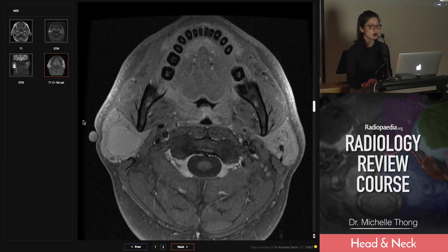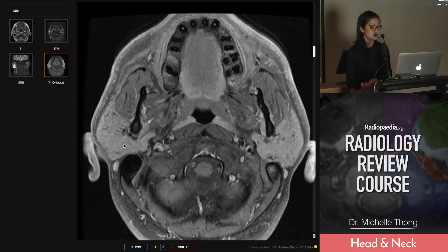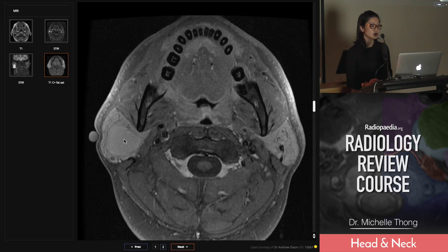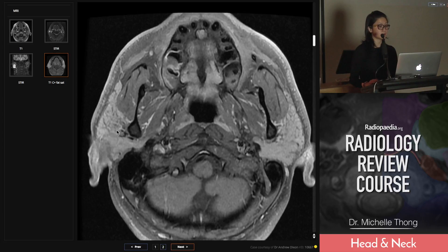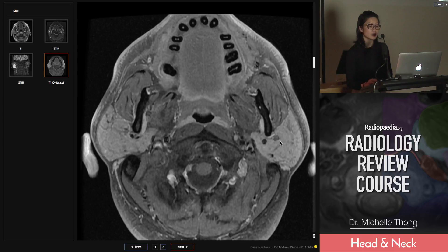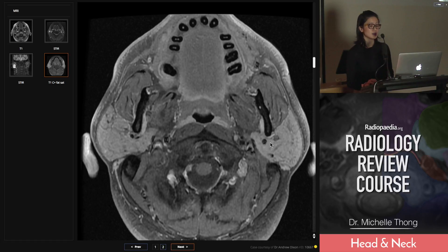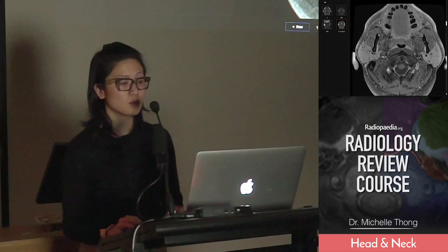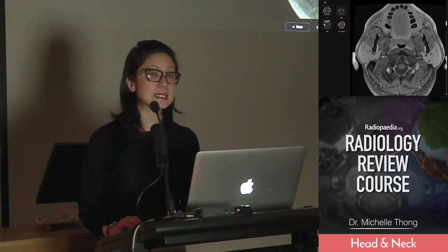We've got to think of other things. On the post-contrast study, this was internally proteinaceous content we saw on the T1, so it's not necessarily enhancing. And again, some of these don't enhance — some are complex little cysts. This ended up being lymphoepithelial cysts of HIV, which are often associated and seen as almost like a reactive change in the parotid glands.